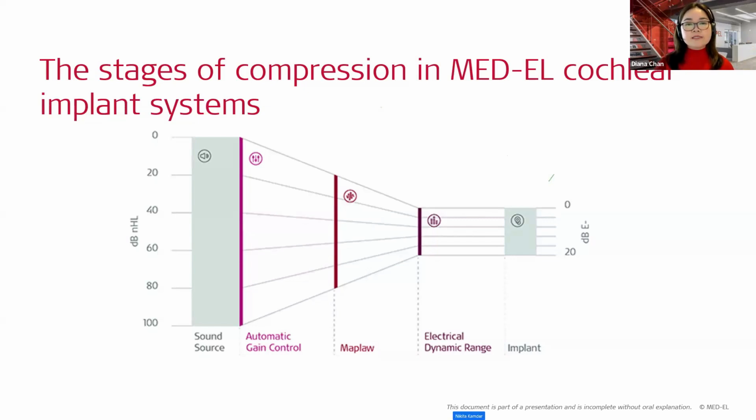One way of conceptualizing the action of the AGC is to picture it as a sound level window that moves the level range up and down to best focus on the current overall level in the environment. Traditional AGCs can compress speech signals well, but what happens if there is a sudden transient sound present along with the speech? The system applies a dual loop design to allow compression of speech, but also respond well to transient sounds. So these parameters mimic the compression process in normal hearing, and additionally provide a relatively good match for compression characteristics for bimodal users.